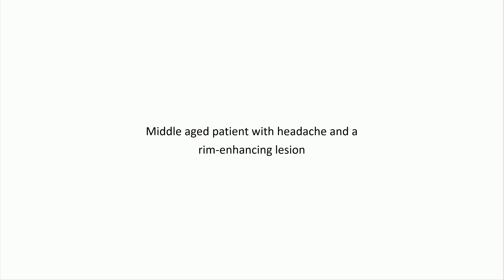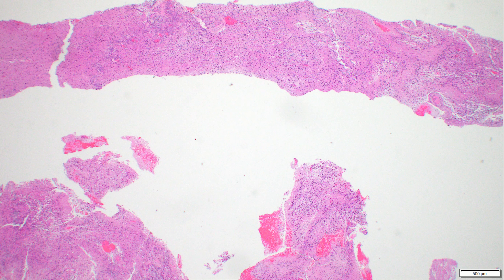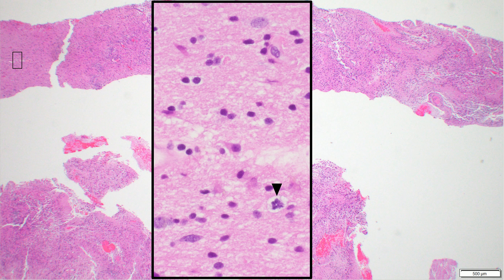So what we have is biopsy tissue from a stereotactic biopsy with a few fragments. This picture has quite a bit of information. Looking in the top left-hand corner, we can see that the brain tissue has neurons here, characterized by round ovoid egg-shaped nuclei with a prominent nucleolus. And we can see these irregular, atypical cells that are kind of elongated, and there's also a mitotic figure right here.